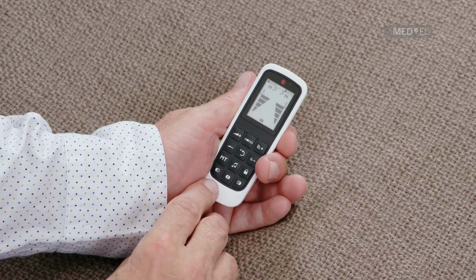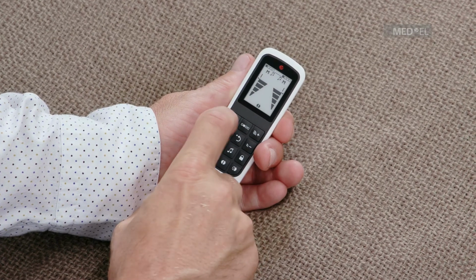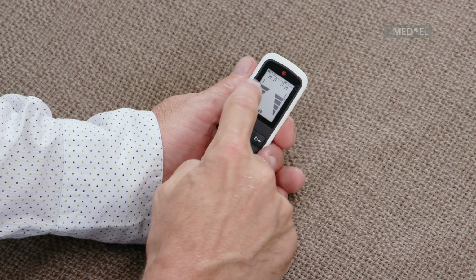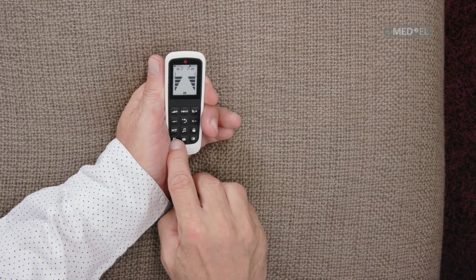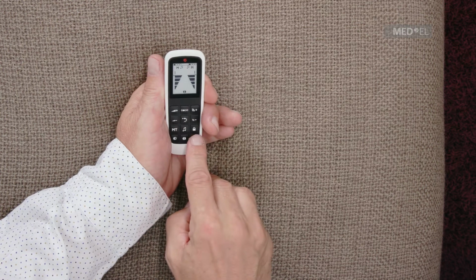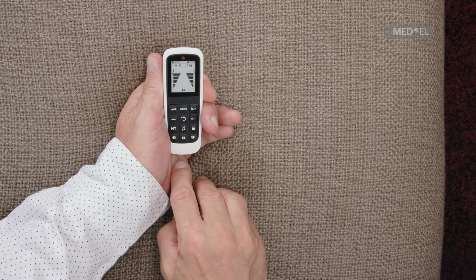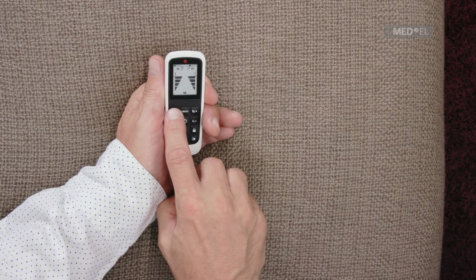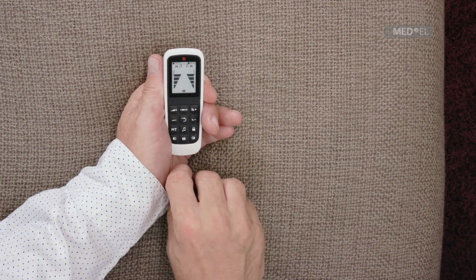All FineTuner Echo functions can be performed with either the left processor, right processor, or both processors. To choose which processor or processors you wish to perform the function with, press the corresponding processor selection key. To turn up the volume with the FineTuner Echo, press the upper volume key. To turn the volume down, press the lower volume key.